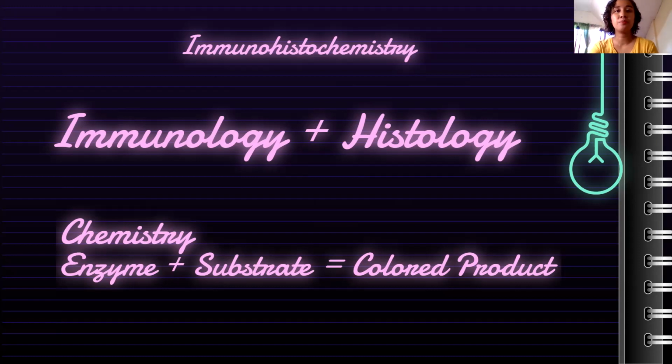So, class, in the process of identifying the specific tumor or antigen, we use immunology. Often, guys, what we are looking for here is an antigen. As we go through our study, I keep mixing up the words antigen and tumor. Usually they should be different, but sometimes the tumors that we are trying to find act as the antigen.